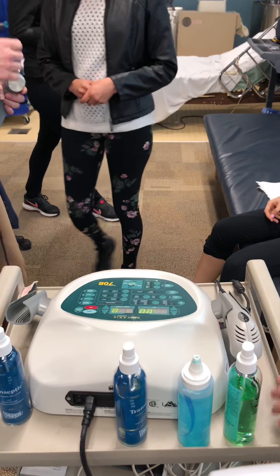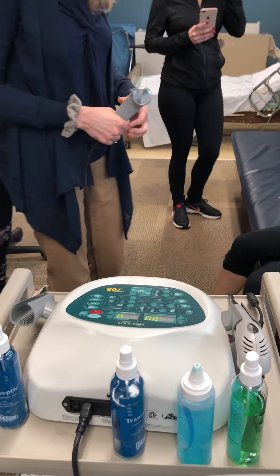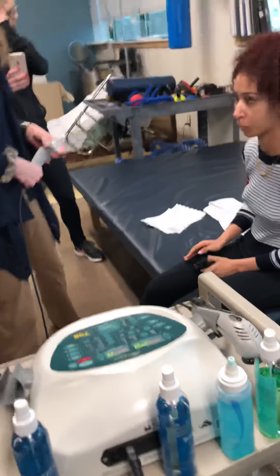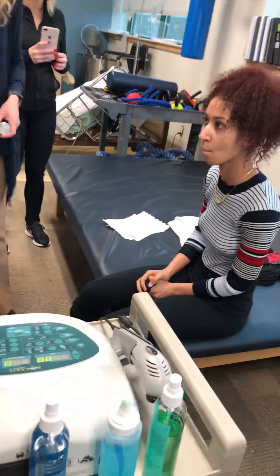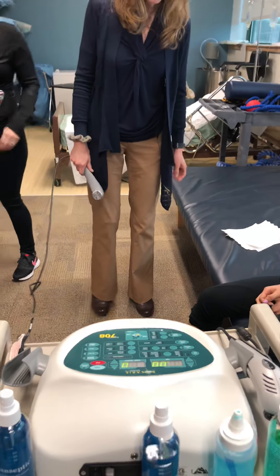Why don't we say she had a lateral ankle sprain — this will help you with your exam.